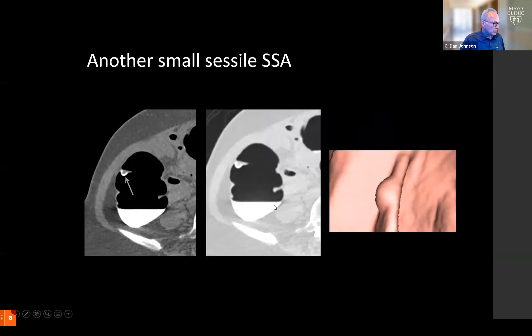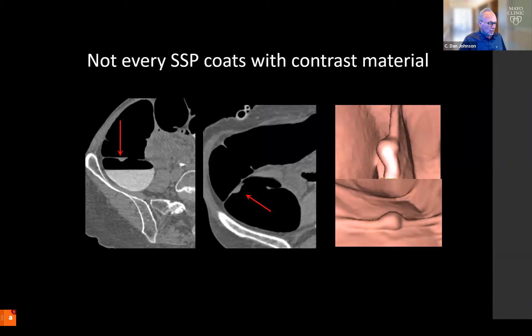Here's another one you can see on the lung windows, a little bit more evident on the soft tissue windows, where you see the lesion as well as its thick barium cap. Not all sessile serrated polyps have adherent barium, so you still have to be vigilant and look for these flat lesions, as shown here by the arrows.